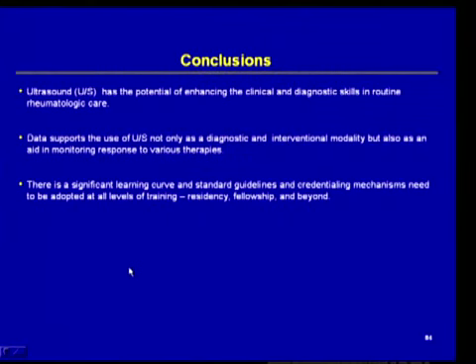So overall, I think ultrasound has really made an exciting enhancement to our clinical and diagnostic skills, whether you're a rheumatologist, someone involved in sports medicine, or orthopedic surgery. The data to support the use of ultrasound as a diagnostic and interventional modality is actually growing. It's actually standard of care in Europe, and in many sites throughout the United States, it is becoming a standard of care, for example, delivering viscosupplementation into areas other than the knee. There is a significant learning curve, and we're hopeful that this DVD will help make some advances to that.